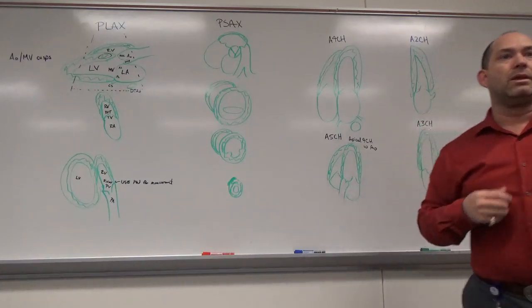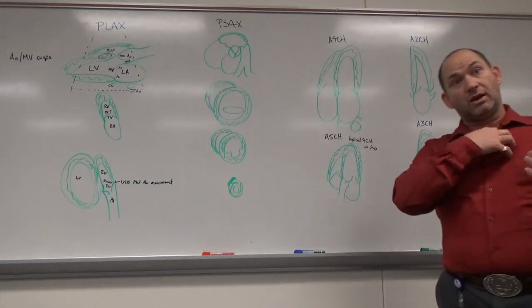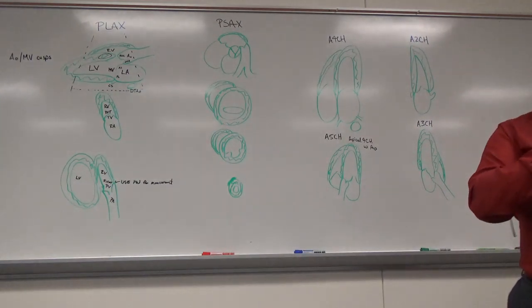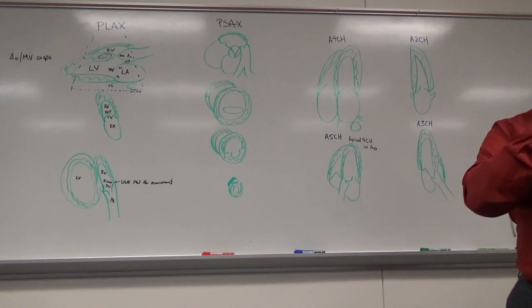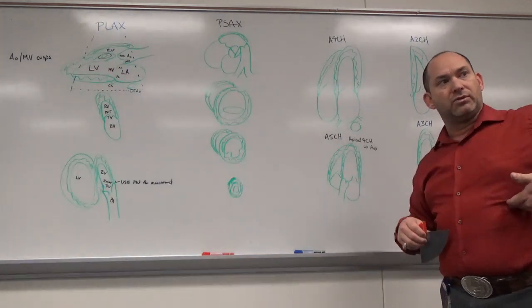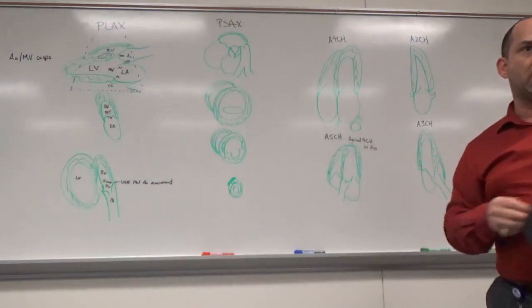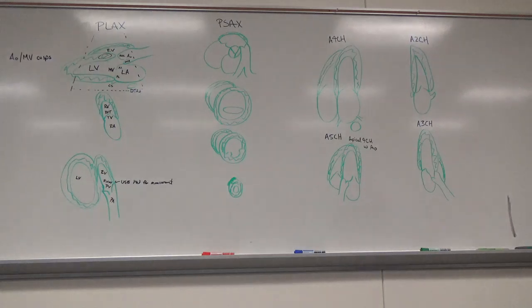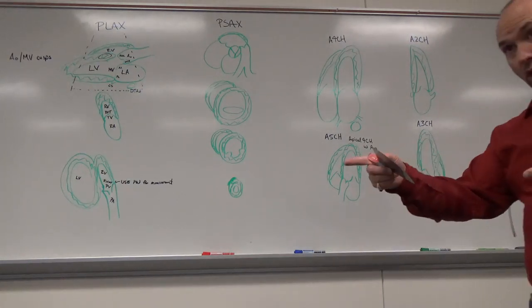And then in addition to that, because it's close to lung, if I have the patient breathe out, that tends to help. So generally speaking on parasternal, breathing out tends to help. And generally speaking on apical views, breathing in tends to help. But is it just a breath in or just a breath out? Holding it? No. They do have to hold it.